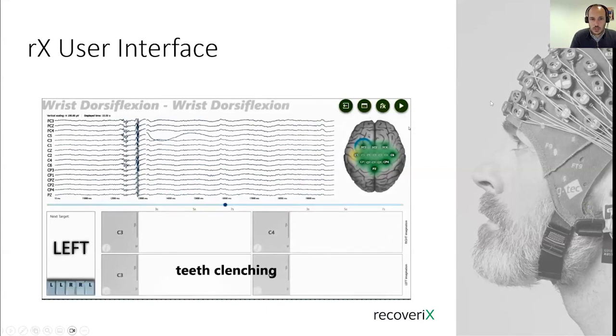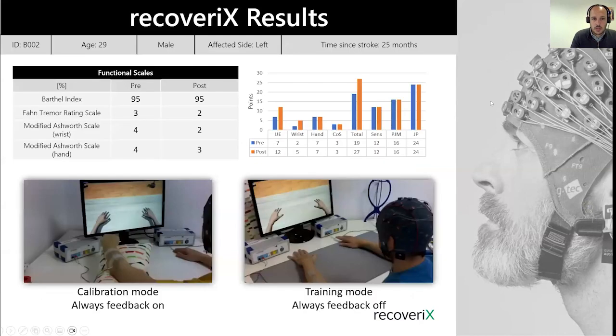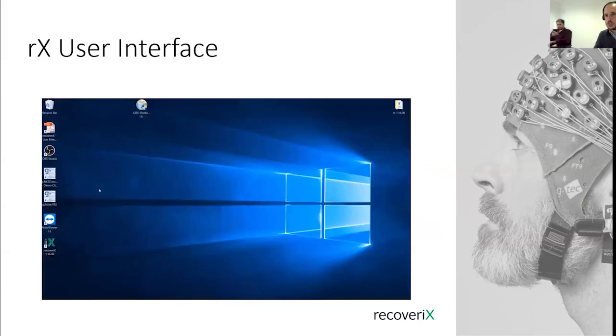So let's go to the real session. We have here Danny. He's one of the recoveriX software developers. So hi, Danny. So we ask him to sit on this chair. Here we have the patient monitor, and on the other side is the therapist computer.